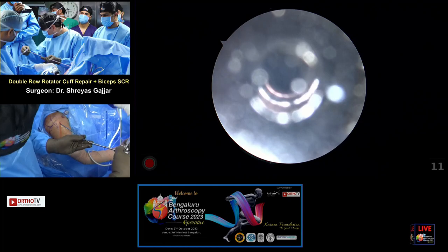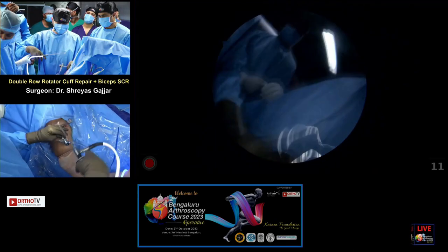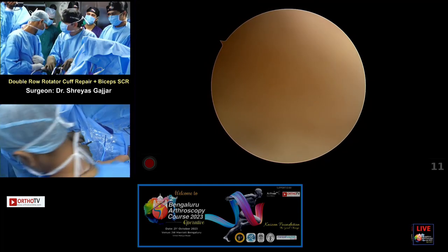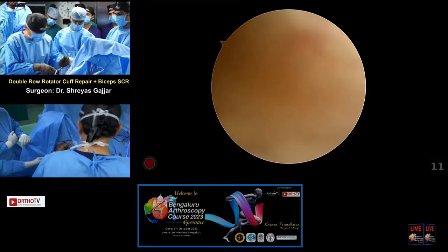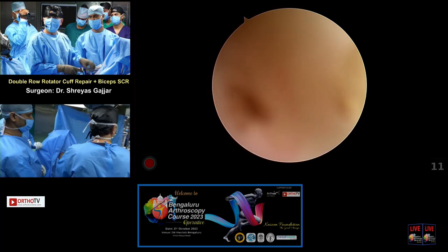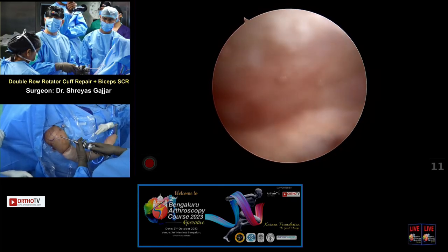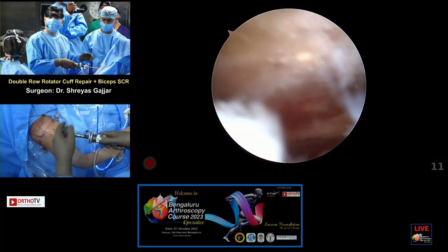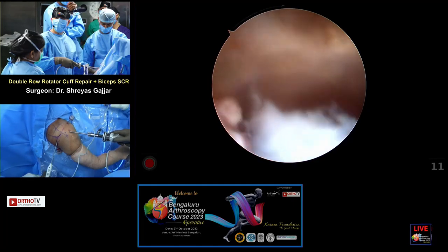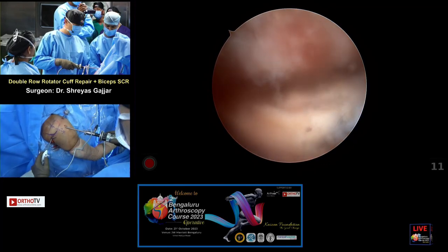Can you take this behind, please, Peter? Okay, sister, he has to come here. Sister, just come here, please. Yeah, that's it. So now we are going to the anterolateral viewing portal. Okay, can I have the RF, please?